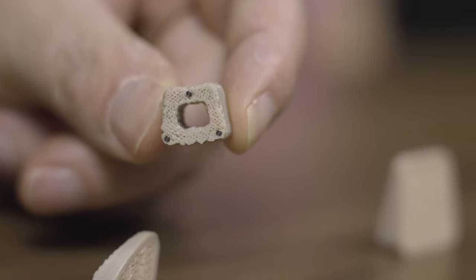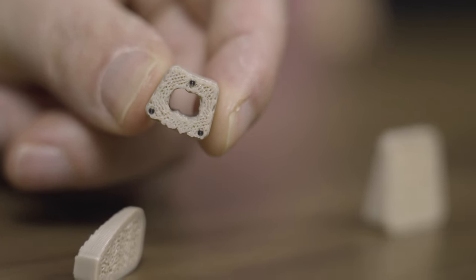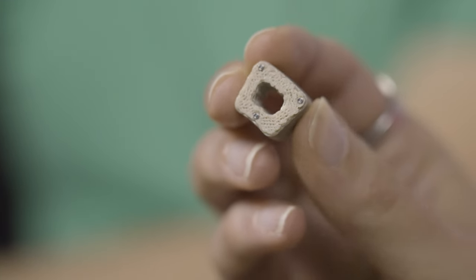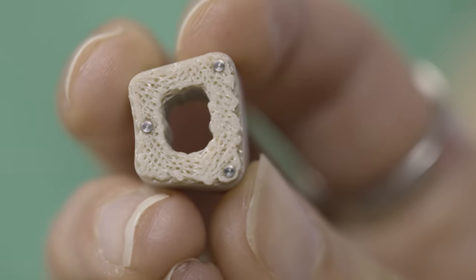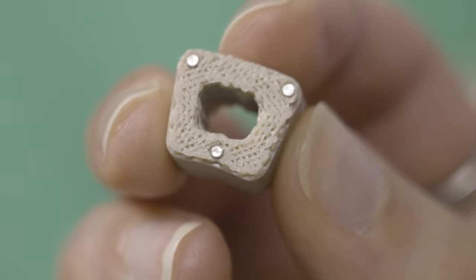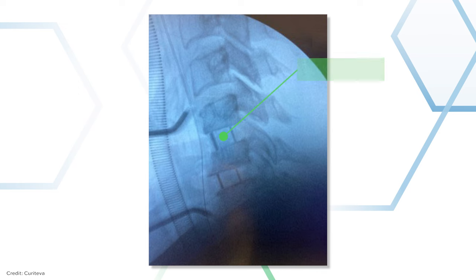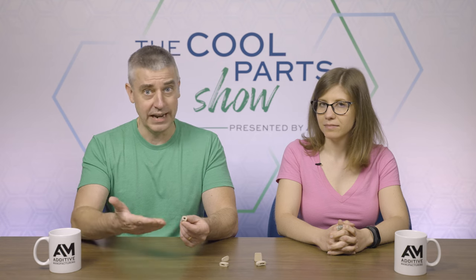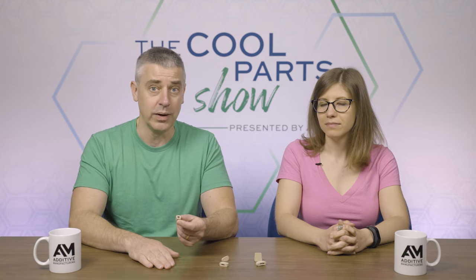These little metal pins in here, they're there for location. The implant is invisible to X-ray, so when the patient is being X-rayed after the implant has been put in, these metal pins help the physician see exactly where the implant is. But the FDA wondered, were these metal pins secretly actually helping with the high compressive strength that this implant had? So, Curiteva 3D printed other test versions that had no metal pins in it to evaluate that question.